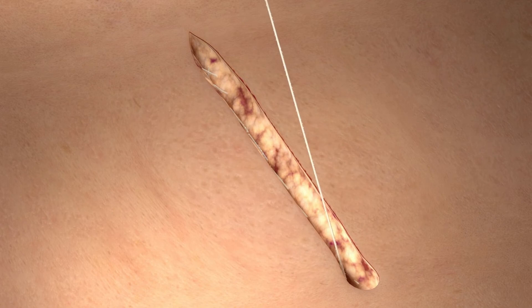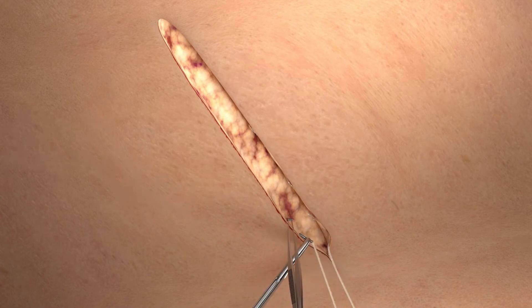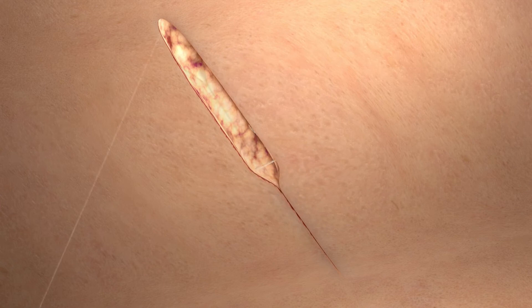we can close the superficial layer with the same Quill Monoderm device in a running subcuticular fashion. Take equal bites of the tissue in the horizontal plane of the upper dermis. It is important to come directly across the tissue line when deploying the device in the subcuticular layer to ensure good apposition.